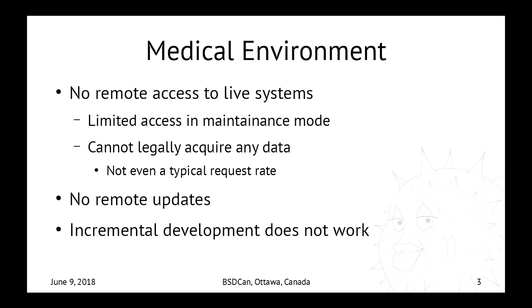There's no remote access to live systems. There actually is a remote access to these X-ray machines, but only in maintenance mode. Actually, the operator screen goes red, and you cannot turn the machine on while the remote access is active, and it has to be granted locally. You cannot legally get any data off those machines. Nothing. No log files, no request rates, nothing. Even if it's not really related to medical data or X-ray, just nothing.